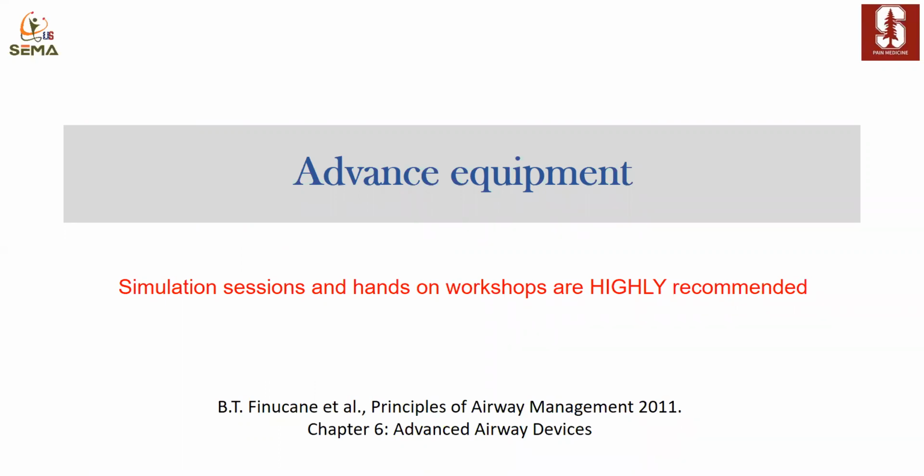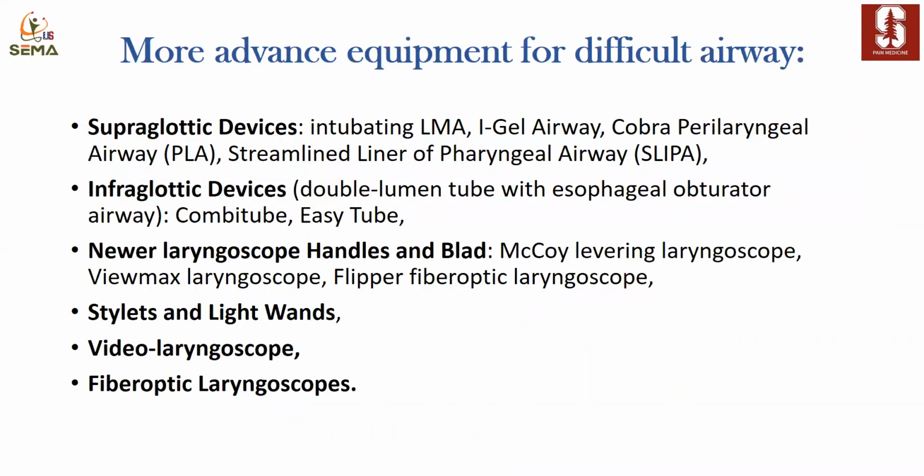You cannot just watch this video or do a couple of cases and feel that you are prepared to deal with such difficult intubation with this equipment. So there are a bunch of them. As we see the supraglottic devices, we have plenty of options now. Many of them help you with intubation.